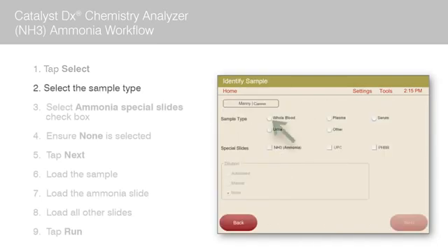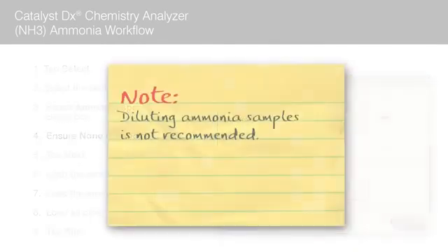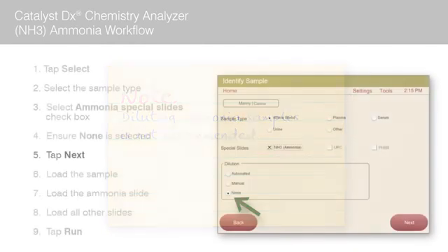Select the sample type. Select the ammonia special slides checkbox. Under Dilution, ensure None is selected. None is the default dilution option. Note: diluting ammonia samples is not recommended.